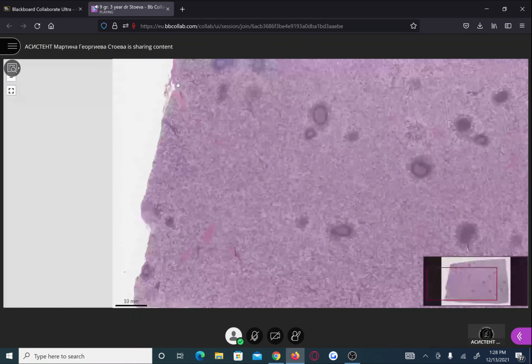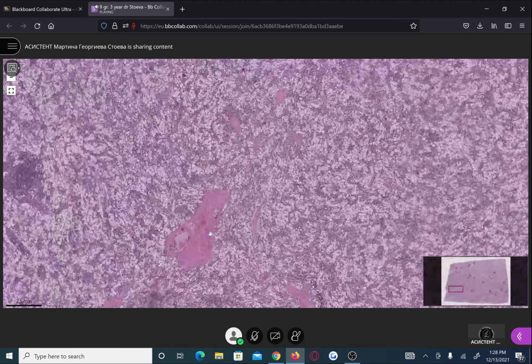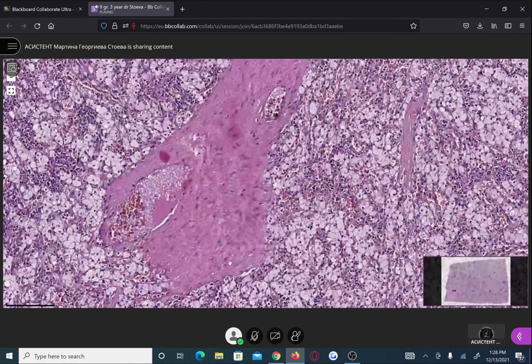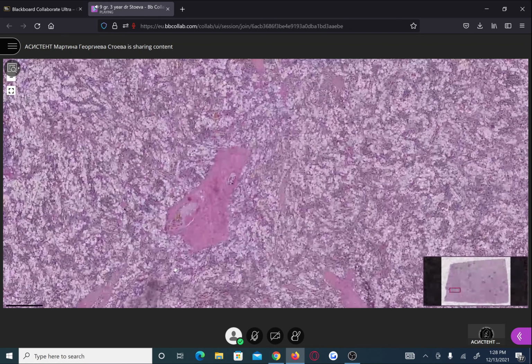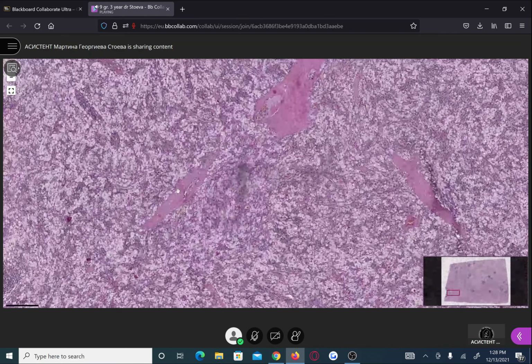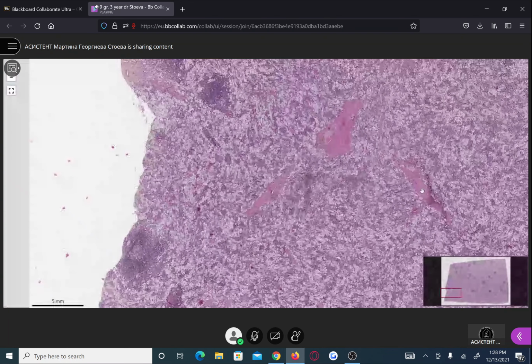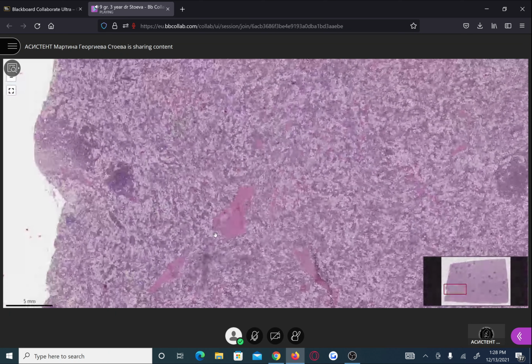And the other characteristic finding in the spleen is trabeculae, these eosinophilic structures. When we zoom in, we can find their components, smooth muscle cells and fibroblasts. Again, characteristic only for the spleen, but not found in the lymph node.